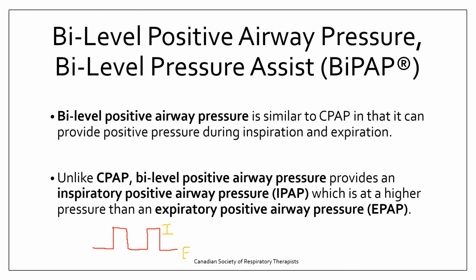It's just good to know how your ventilator works, and whether you're going to be adjusting a support or if you're going to be adjusting an inspiratory pressure and an expiratory pressure, so that you don't make any errors and cause your patient to have changes within their ventilatory status. So if we're looking at this sort of situation, that difference between your inspiratory pressure and your expiratory pressure, that change, that delta P, that's really going to affect ventilation.